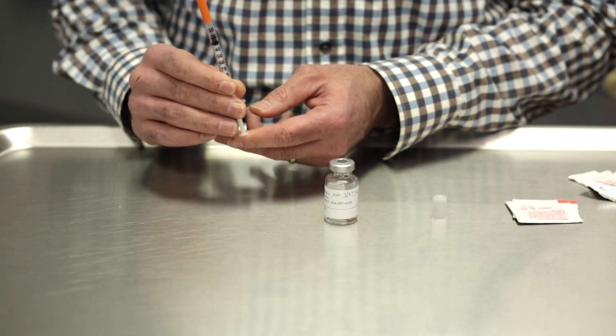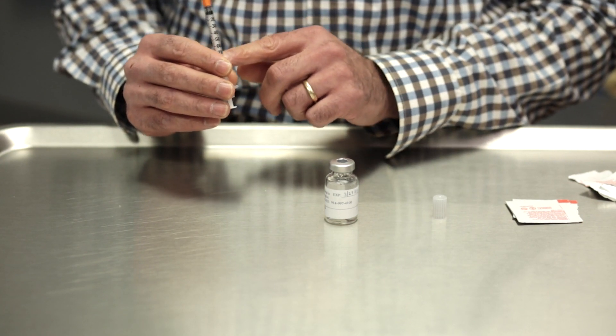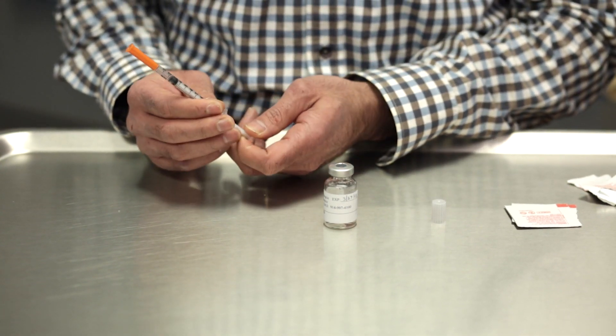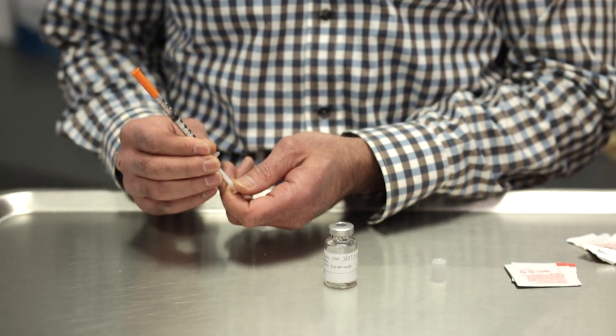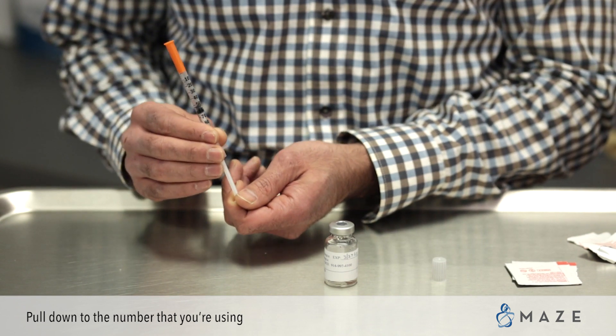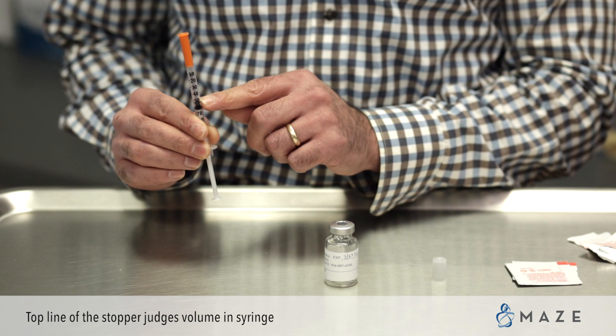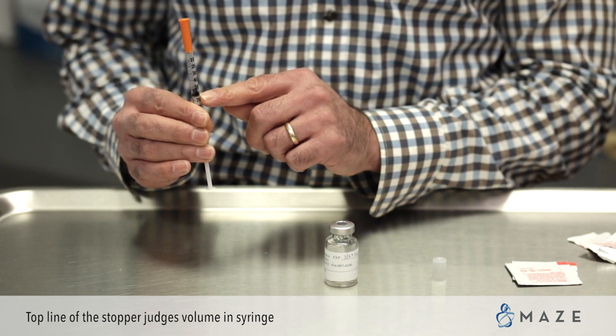When using an injection, everybody will have their own dose in terms of volume. The easiest way to draw up an injection is to pull down to the number you're using. In this example, we're going to use 50. It's the top line of the stopper that judges the volume in the syringe, not the bottom line of the stopper.